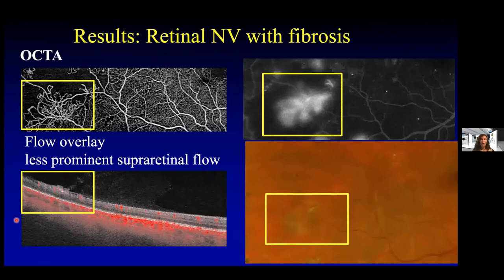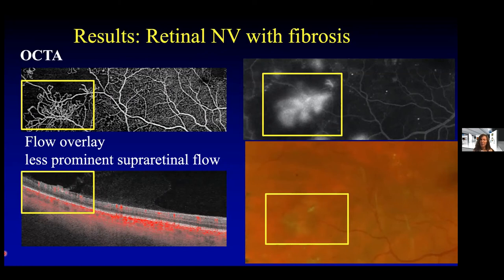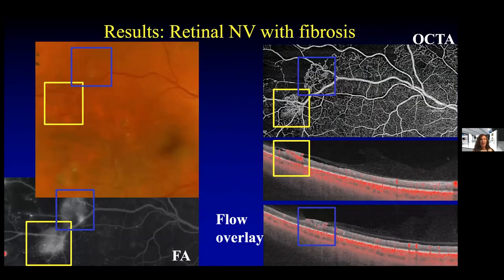One finding we noted was that when eyes had retinal neovascularization associated clinically with fibrosis, there might be less prominent flow overlay and less prominent supraretinal flow. On the bottom right, we see some fibrosis in this eye with retinal neovascularization confirmed by the fluorescein image. Here's the OCTA image, and here is the structural OCT with flow overlay — there's still some flow above the ILM, but it's not as prominent as in the previous cases.